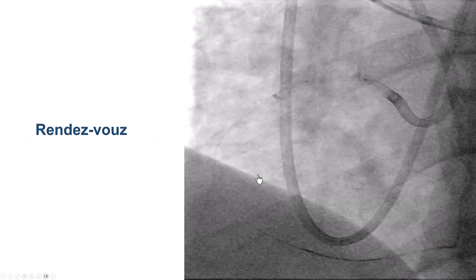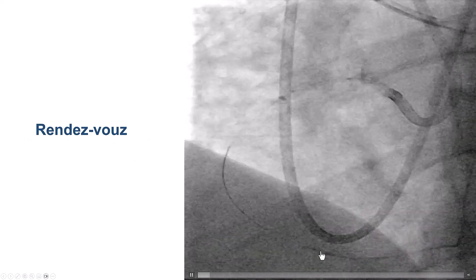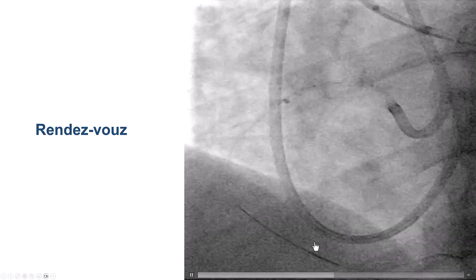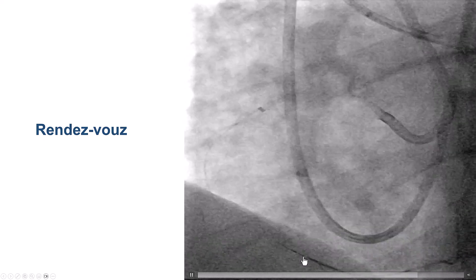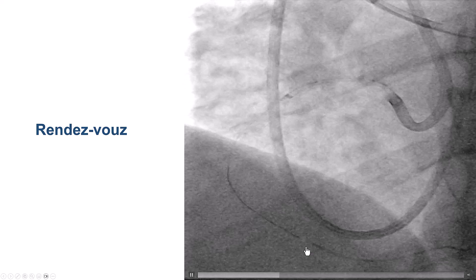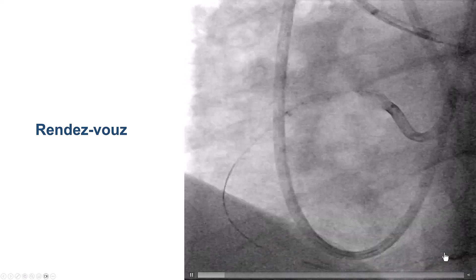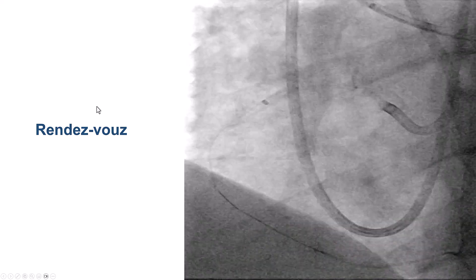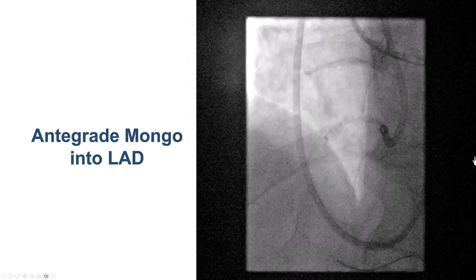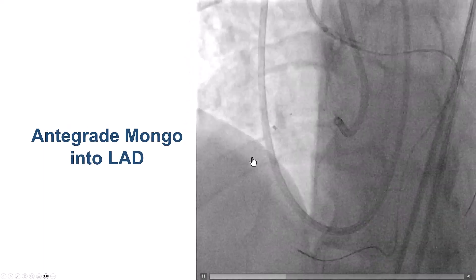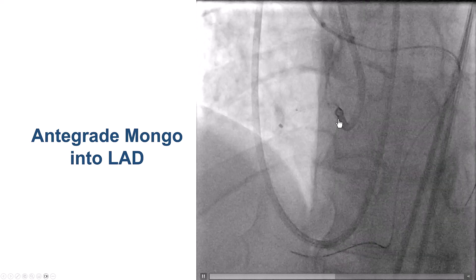We then used a technique that is not very commonly used — only in about 5% of retrograde cases — called the rendezvous. We pulled back the retrograde wire and advanced the antegrade wire, which went right into the retrograde microcatheter. This is the rendezvous technique. It accomplishes two things: first, it confirms that we are in the distal true lumen; and second, the wire now extends far distally, providing strong support for delivering antegrade equipment. We also used a guide extension on the antegrade guide catheter.